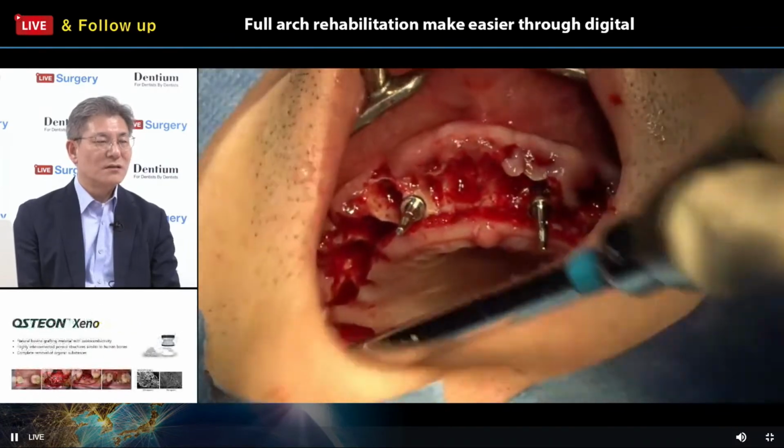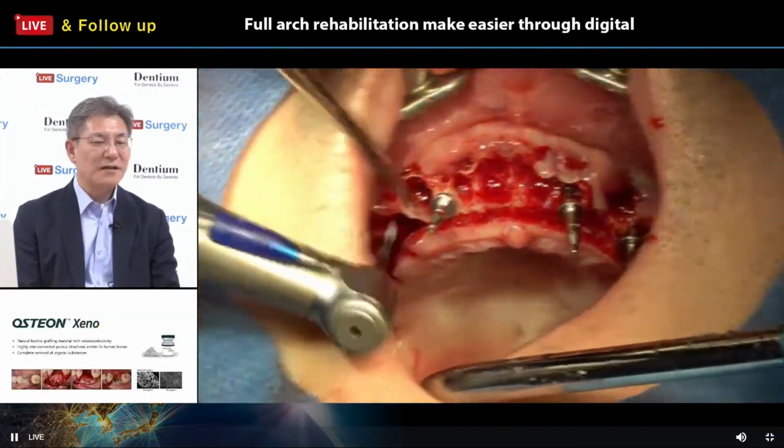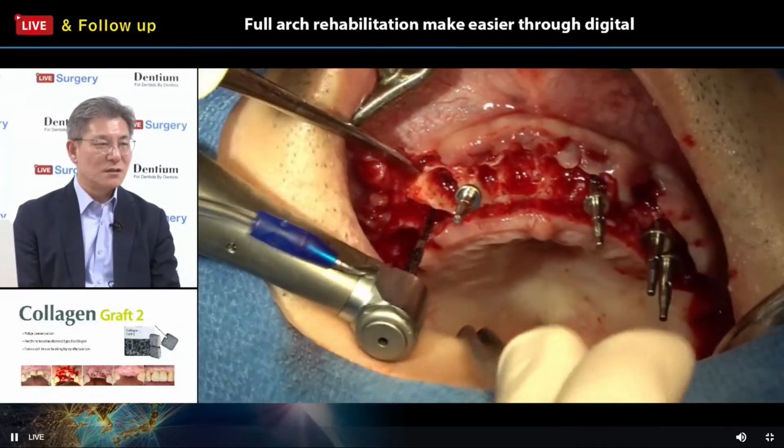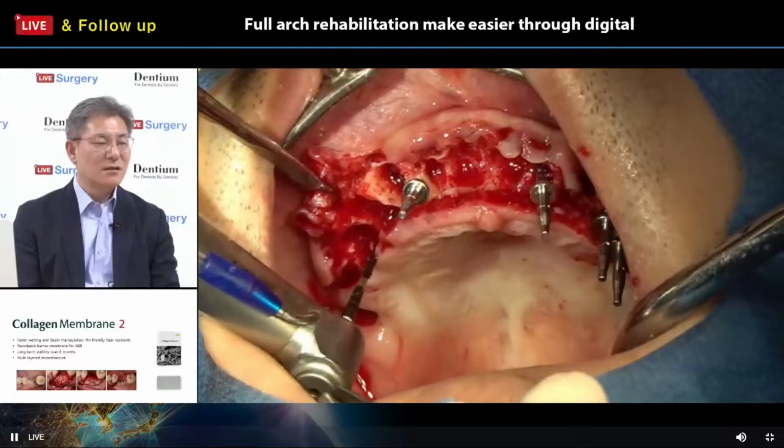As you know, the labial position is the original, pointed by the stent. However, Dr. Chung modified some of the palatal areas, moving the starting point for the osteotomy site.